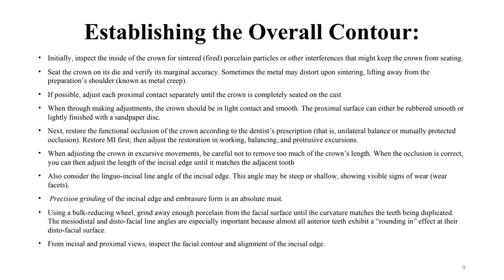So you have to be careful when you do a crown and you see that the patient has that texture, not only to put the texture in the tooth, but also when you put the glaze, that glaze is going to cover that texture. So maybe you want to texture it a little more, so when you put the glaze on, it kind of gives you that illusion of texturing. All right.